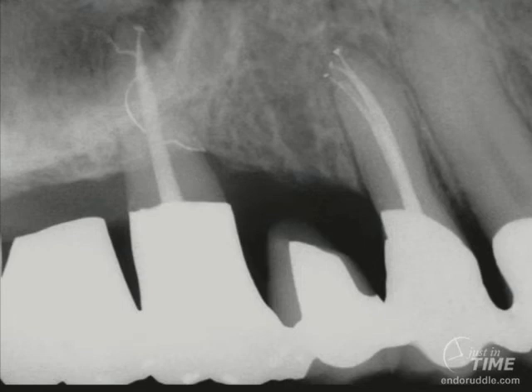When you look at the potential of a warm gutta-percha technique, you can see in this 28-year recall that this is the lone palatal root in a 6-unit splint. In this palatal root, which is the pier abutment, notice the deep bifidity, the loop, and the crestal portal of exit. Great endodontics is the foundation for perioprosthetics and long-term success.